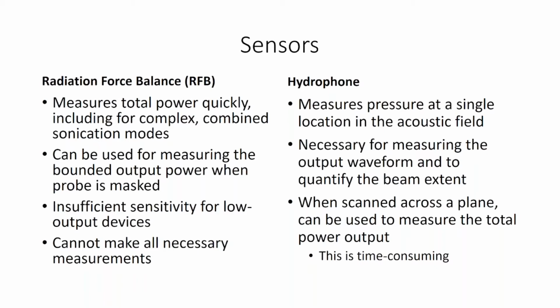I wish to note that for diagnostic imaging measurements in our lab, we very often determine all the necessary values just with a hydrophone measurement, usually because of issues related to the sensitivity of a radiation force balance. It is also worth noting that historically, when we have compared the results that we've gotten, at least within the range of valid performance for both sensors, we've been able to achieve good agreement between power measurements made with the radiation force balance and power measurements made with the hydrophone.